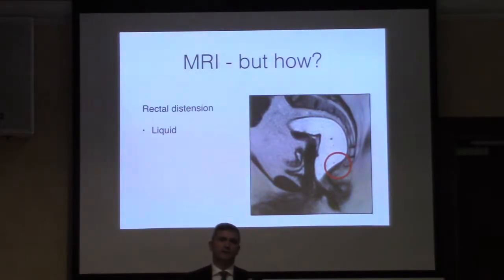Because it interferes with your diffusion-weighted imaging. You get an artifact with the high signal T2, so actually you lose a lot of that surface detail. So distension is good for early tumours, and you can consider using gas, but in fact I wouldn't recommend using gel. It looks nice, but actually the pictures won't be that helpful in the long run.